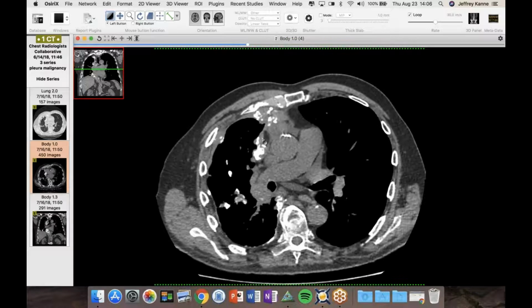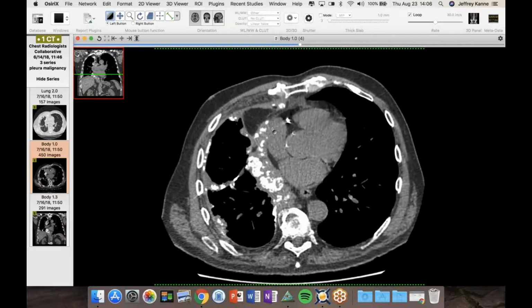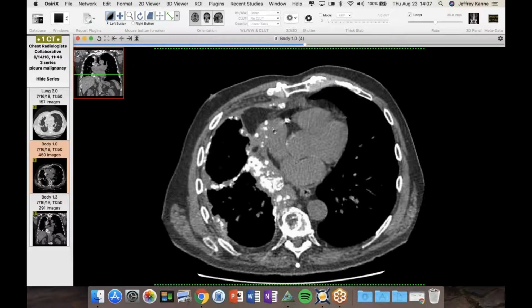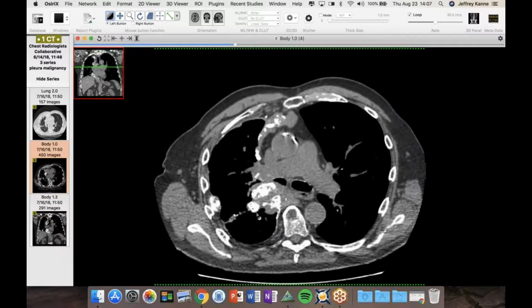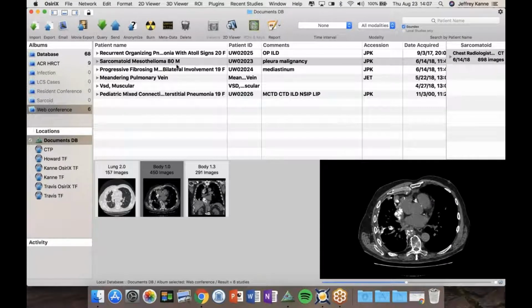Absolutely. Yes. Yeah. I've seen metastatic sarcomas go to the pleura with matrix, but he has no sarcoma anywhere else. And with the pleural invasion, the rind, the mediastinal and extrapleural fat invasion, I couldn't make it anything else. I believe he did have an asbestos exposure documented somewhere in his chart. It's a really quite exuberant case. I wish I had a radiograph of it, but I wasn't able to get a hold of one. You can see there's even this big mass effect right here on the airway. And it's growing around the pleural surfaces and in the interlobar fissures, pretty typical of that too. Yes, exactly.